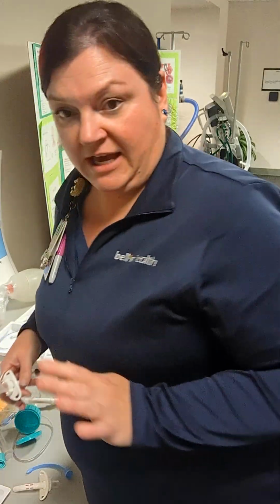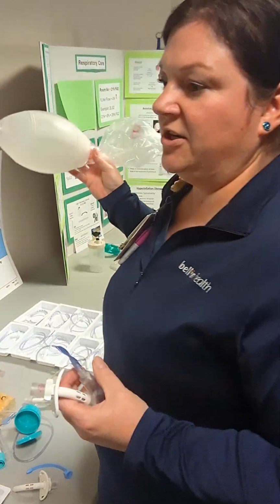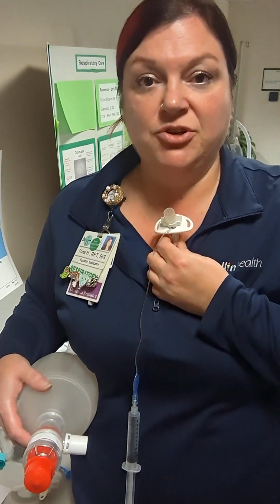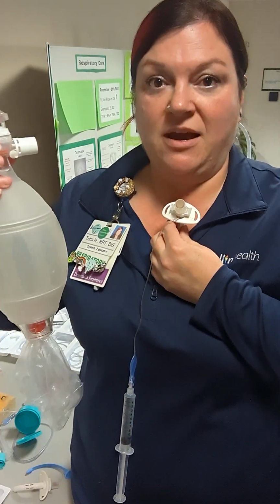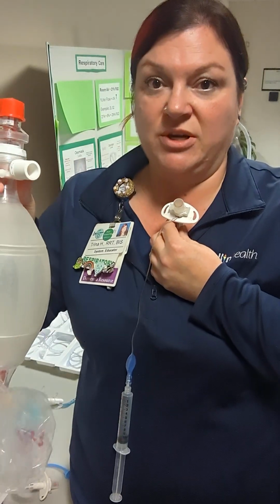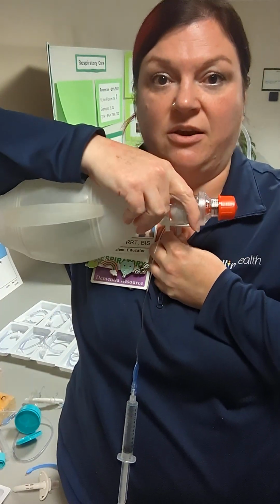And in case of an emergency, if you're having issues and you decide, nope, they're not breathing effectively, if they have a trach, you are not going to use the ambu bag and mask at the oral airway. You are going to take the mask off and you're going to go right on the trach here.